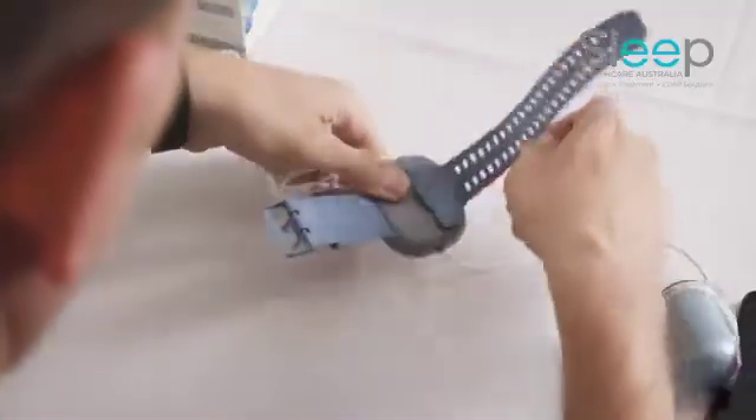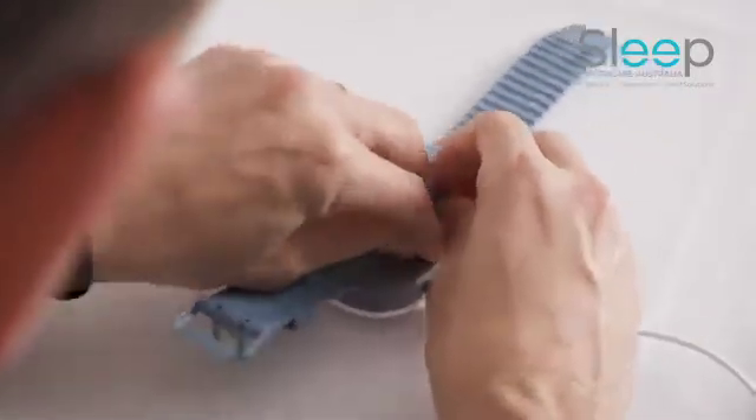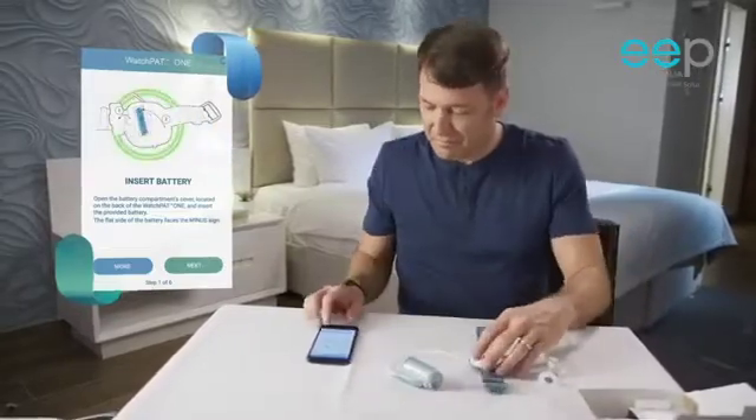Insert the battery into the Watchpat 1 device. Make sure the green indication light blinks. Press next.